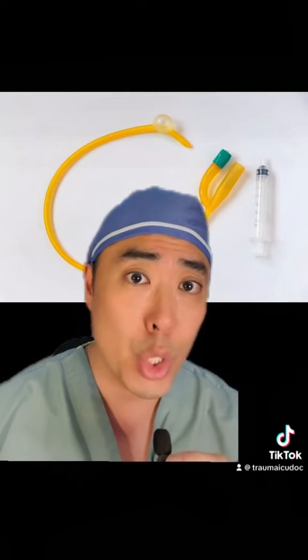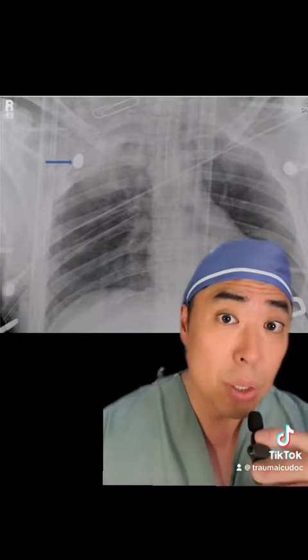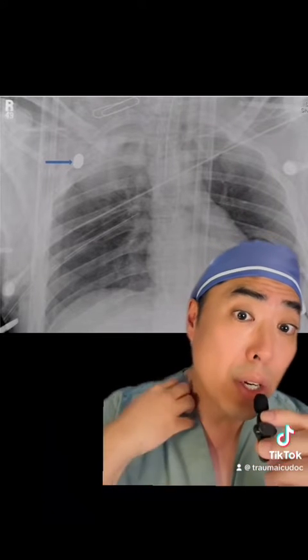You would be surprised at the number and types of organs that I've stuck a Foley catheter balloon in. One particular situation in which Foley balloon tamponade can be very effective is among patients who have been stabbed or shot in the supraclavicular fossa — you can see a bullet here lodged below the clavicle with a pleural hematoma — and these patients can hose out of their subclavian vessels, which are usually not amenable to digital pressure.